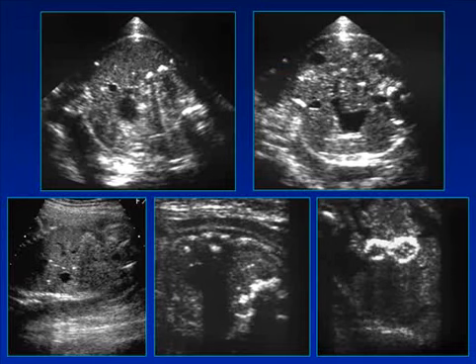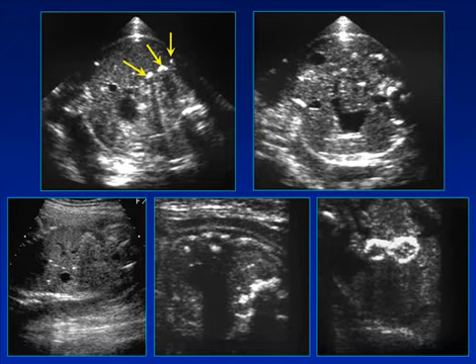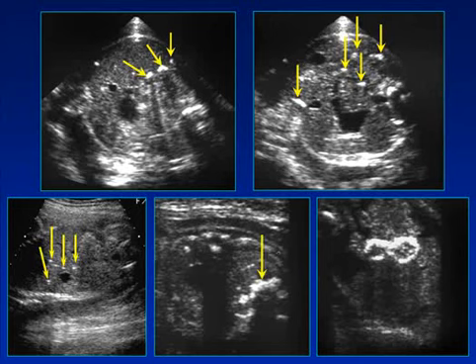And as a result, one can get highly echogenic, punctate, curvilinear, or clumped foci that may or may not have shadowing. So here are some examples of the calcifications that one can see in the fetal abdomen in the setting of meconium peritonitis. Here are some very coarse calcifications with posterior shadowing. In this fetus, though, there are multiple calcifications but no posterior shadowing. This fetus has scant calcifications, no shadowing. And this fetus has a very large clumped calcification, very coarse, with shadowing. Finally, this fetus has a figure 8 configuration calcification as the calcifications wrap around the outside of two adjacent abutting loops of bowel.